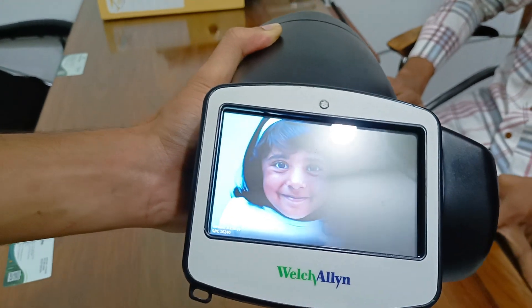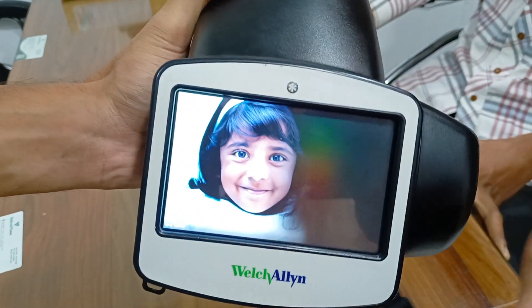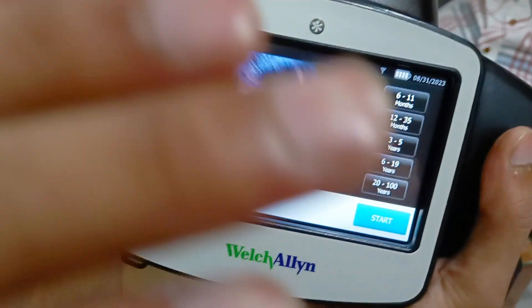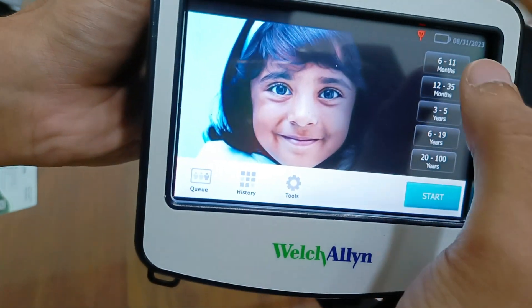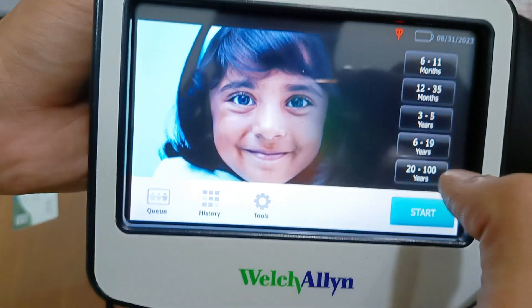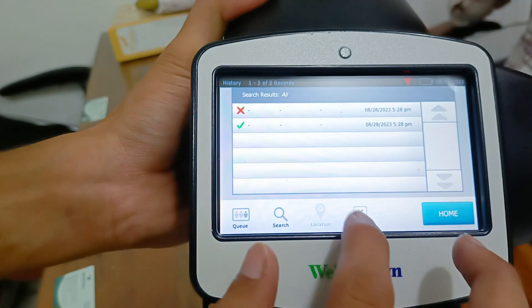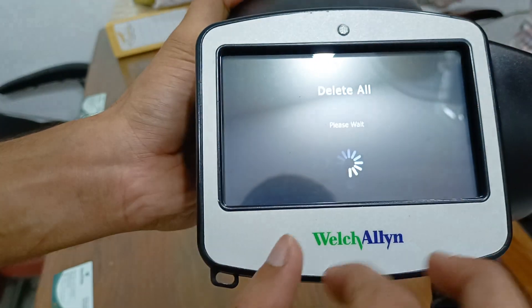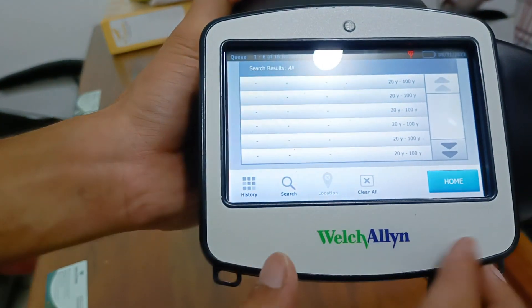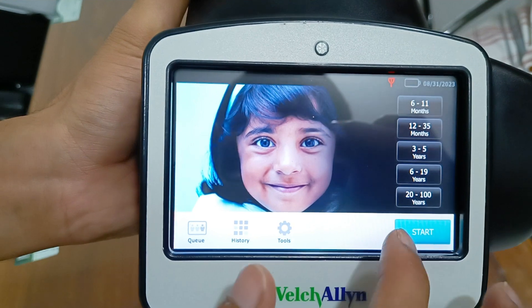This is the start screen. You can use this auto-ref for age ranges: 6 to 11 months, 12 to 35 months, 3 to 5 years, 6 to 19 years, and 20 to 100 years. Here you can see history is available. Clear home and start.